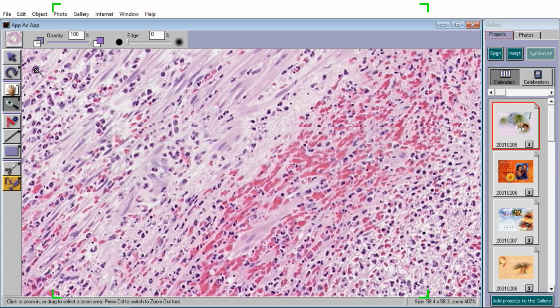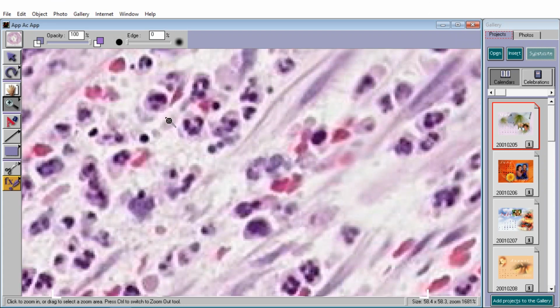Now, I'm going to see if you're going to get this one right. I might even ask the question, okay, if this and this and this and this and this and this and this are the inflammatory cells, which are infiltrating the smooth muscle layers. Now here's a smooth muscle cell. Here's a smooth muscle cell. Here's one. Here's one. Here's one. Probably here's one. If the primary cell of inflammation is a neutrophil rather than a lymphocyte, would you call that histopathologically acute or chronic inflammation?